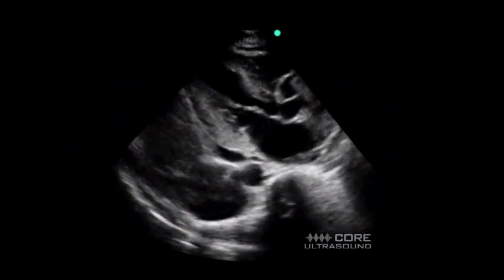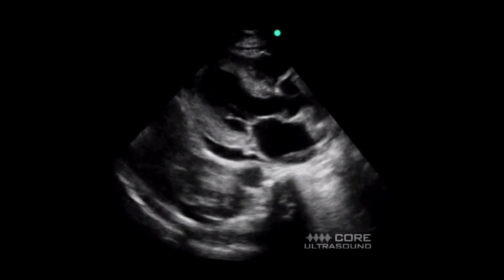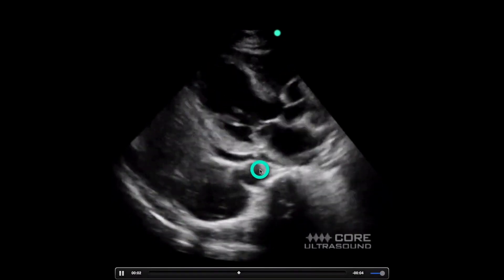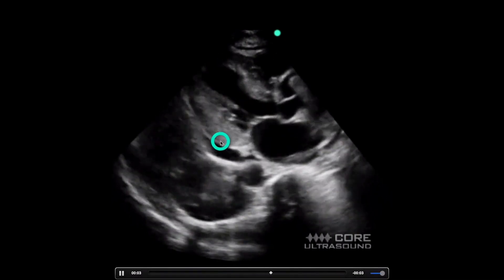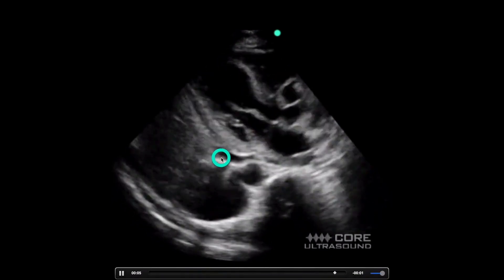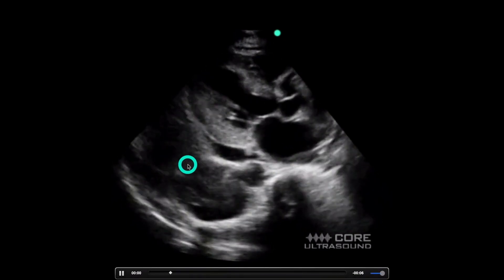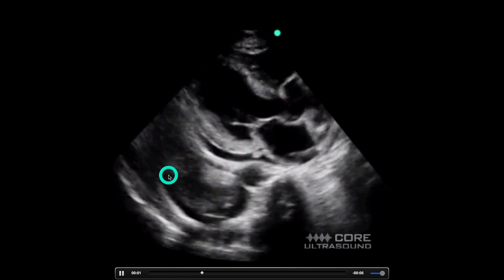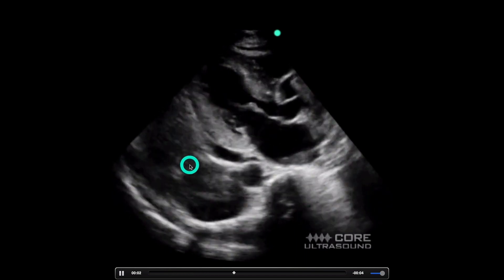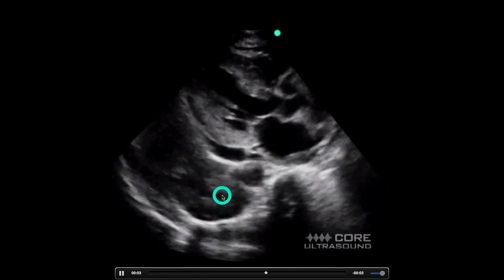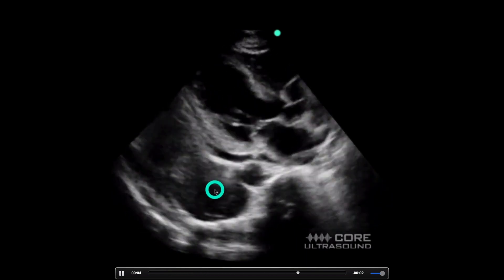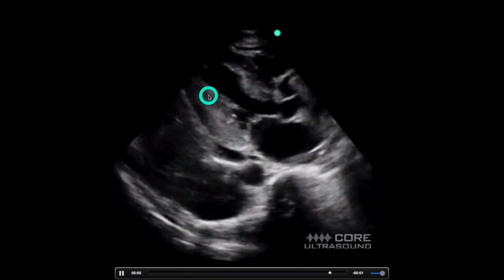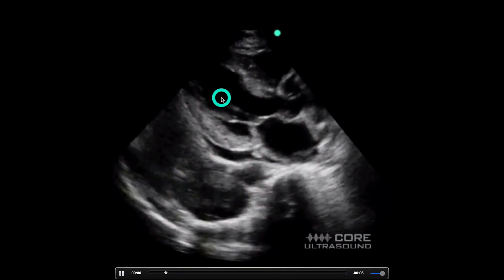And this of course is an example of both. Here we have the descending aorta, a small pericardial effusion, as well as a pleural effusion down here. This wavy stuff in here, by the way, is a mirror artifact of the heart above.